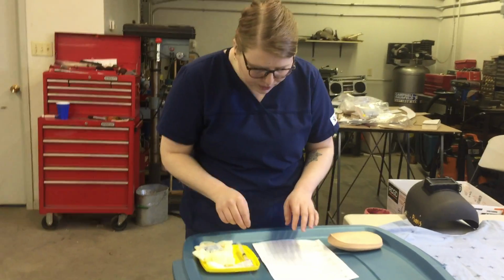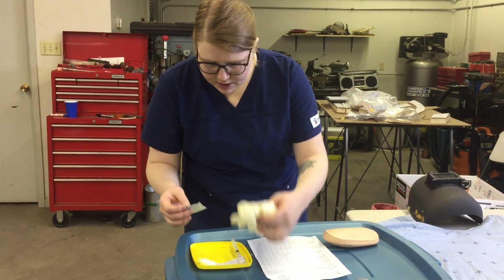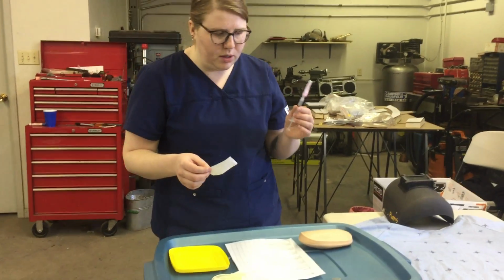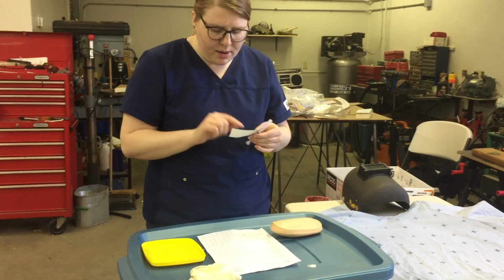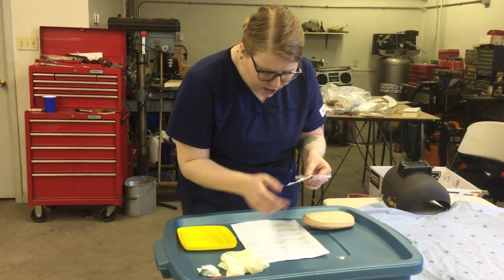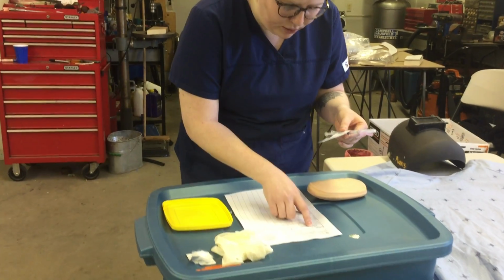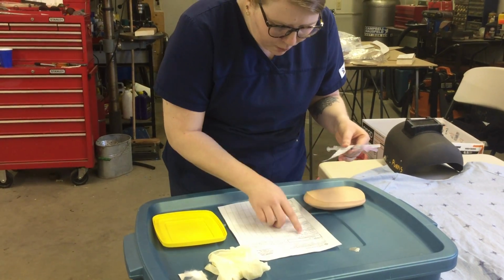So after I've done that, I'm just going to set up my station a little bit here. So we have my alcohol swab, there we go. So I'm going to be doing my third check here. So I'm going to be comparing my syringe with my label with my MAR. So we have Jake Nursing, right patient. So it's January 1st, 1960, date of birth. He has no known allergies. So that's good.